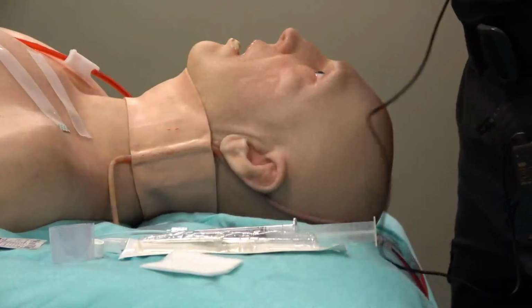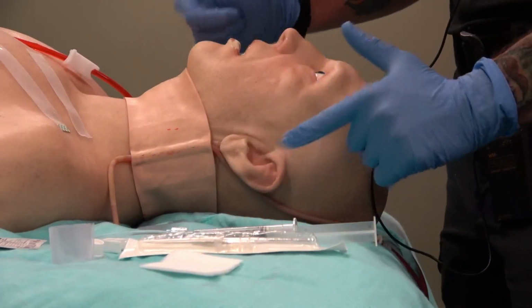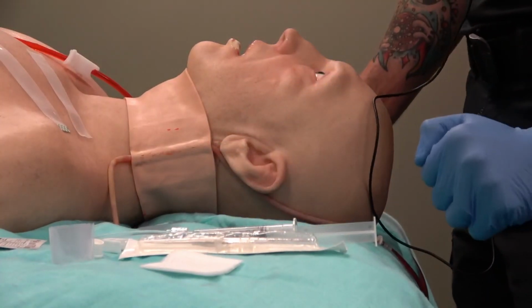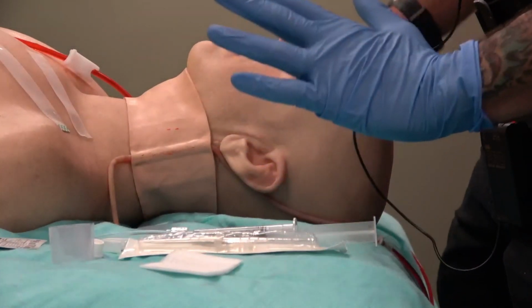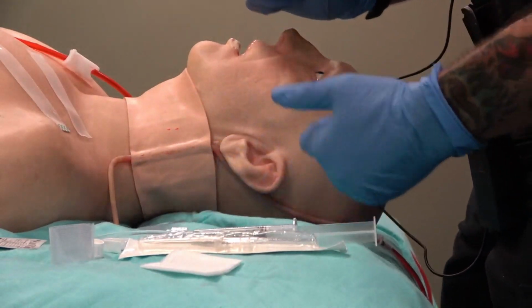Now I'm going to strap on a trainer and let's do the skill. All right, now we're to the point where we're actually going to do the skill. I have a training mannequin with a slick little EJ trainer, and we have identified the site. It's pretty easy to see right here.